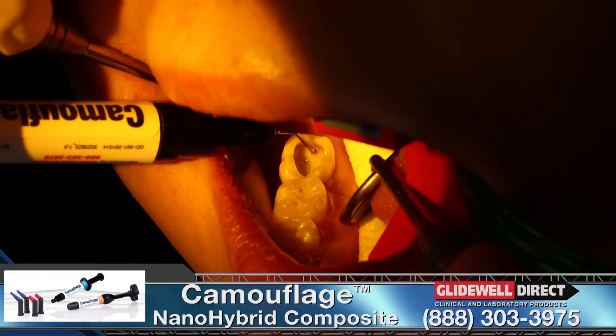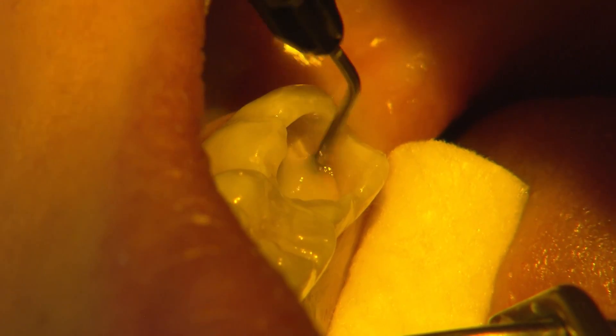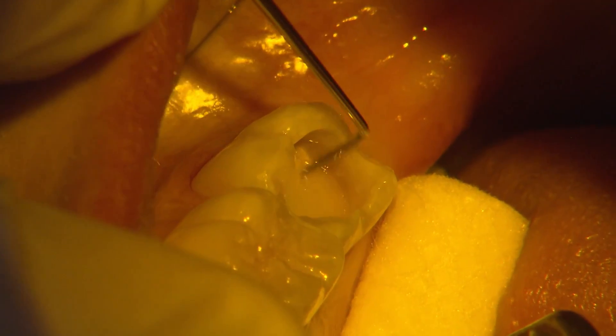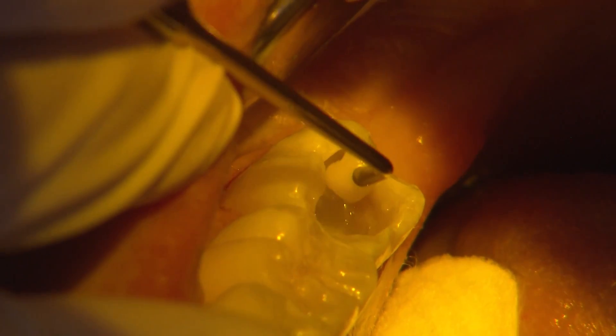I begin the restoration with a thin layer of camouflage flowable to adapt to the pulpal floor. Then I build up the restoration with camouflage universal A1 enamel. The material is very easy to adapt to the cavity walls and shape to the desired form. I place and cure each cusp's support individually.